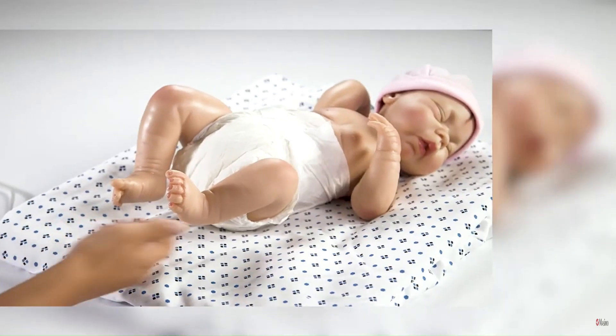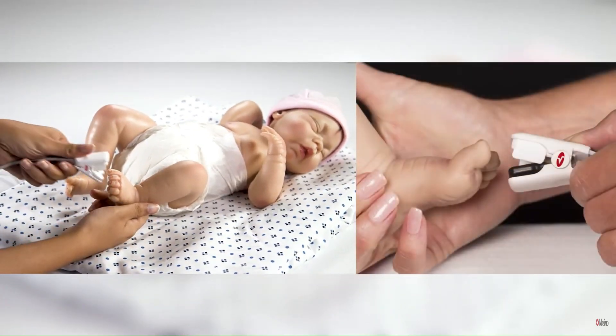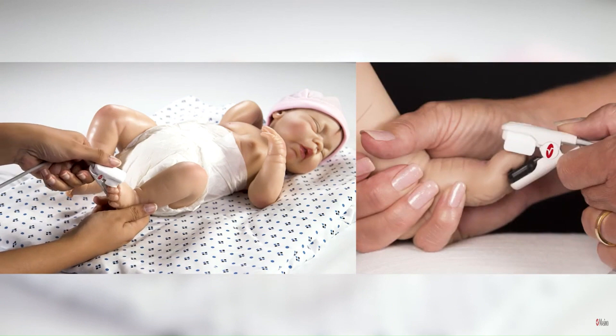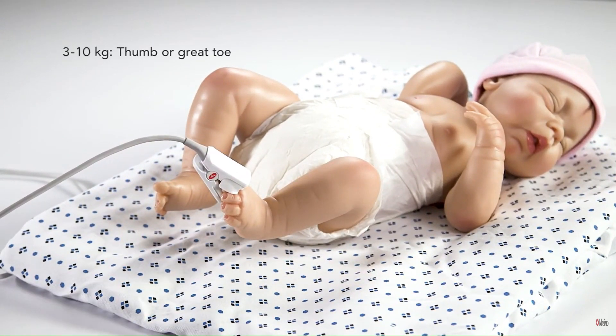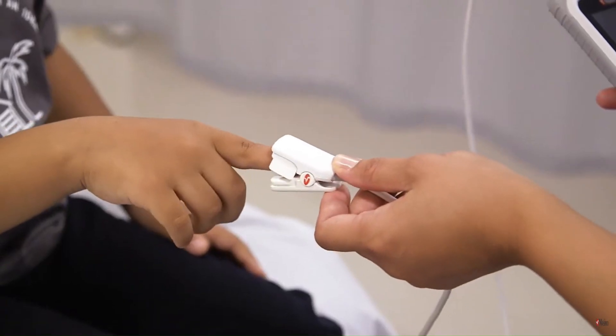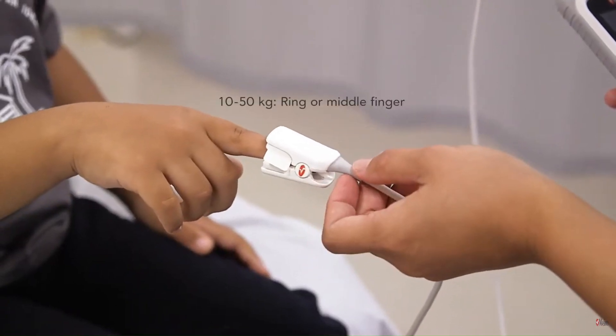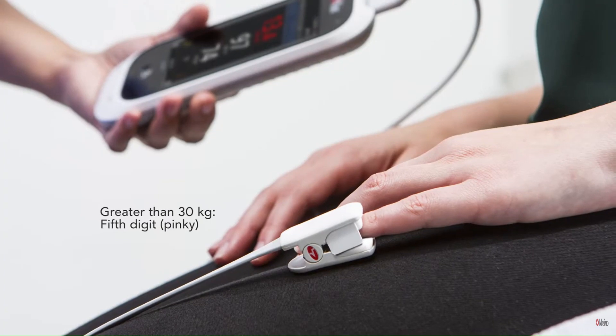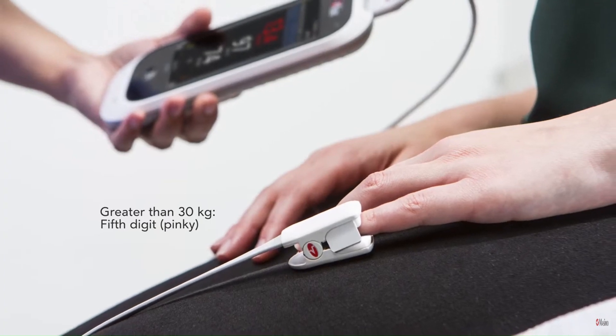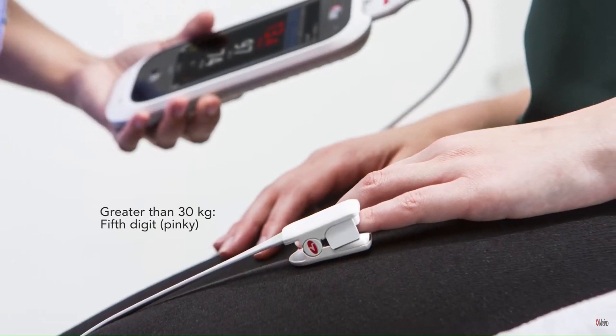Select an appropriate site for sensor placement. The preferred site is determined by weight range. For infants 3 to 10 kg, the thumb or great toe are the preferred sites. For paediatric patients 10 to 50 kg, the ring or middle finger are the preferred sites. For adults greater than 30 kg, the preferred site is the fifth digit or pinky of the non-dominant hand.